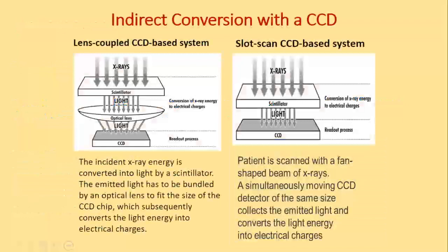And then came CCDs. You remember the RVGs that we had? I'm sure some clinics would still have RVGs. Some panoramic machines are not film based, but have a CCD sensor. That was the second generation, I would say, when you shifted over from CR to RVGs. It's great. RVG gives you a better image quality. The CCD sensors give you better image quality.